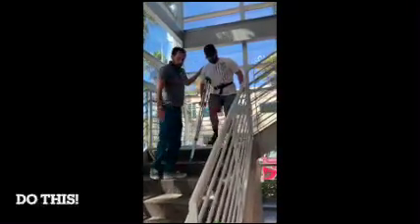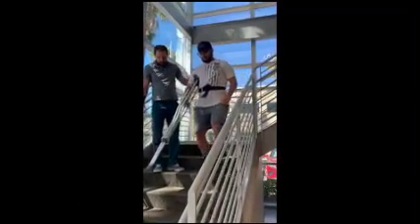So if we're on the same side, we only have the railing on one side, you are still going to bring the other device into your right hand. You're going to step forward onto the landing, and then you can go ahead and turn towards the rail. And then you can bring the device back into your right hand. Hold on to the railing for me, and then I'll come back down. And then we would proceed going down just how we did before. Come on down. So that would be non-weight bearing with 2 crutches.